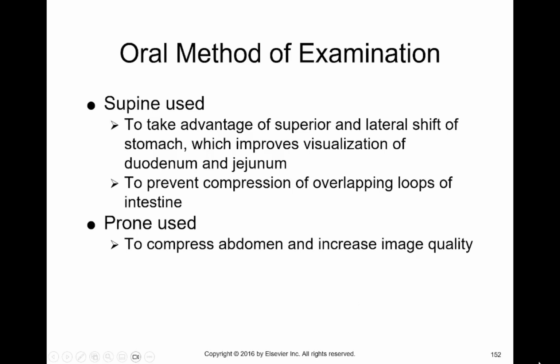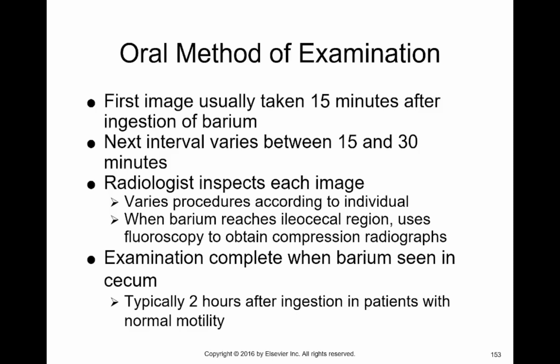Patient body position doesn't really matter if you take the x-rays with the patient supine or prone. There are some benefits to each, but really, in my experience, patient comfort is the most important thing. And in most cases, your patients are going to be more comfortable lying on their back as opposed to on their stomach. Now, there are times that you may want to flip the patient over onto their stomach, specifically whenever you're trying to spot the ileocecal valve. You may want the patient to lie on their stomach on a paddle or some sort of compression device in order to visualize that a whole lot better.